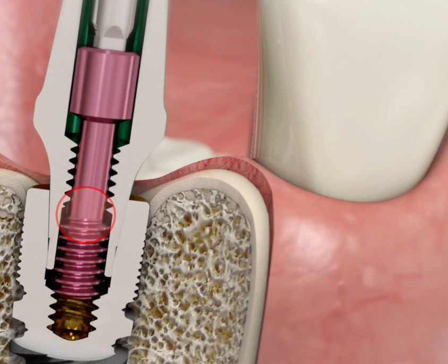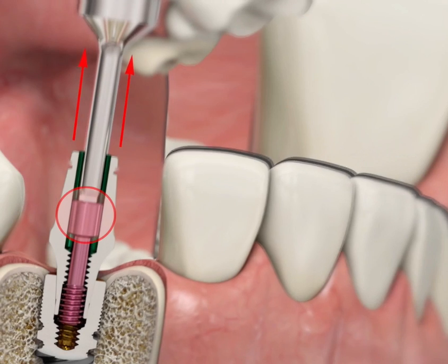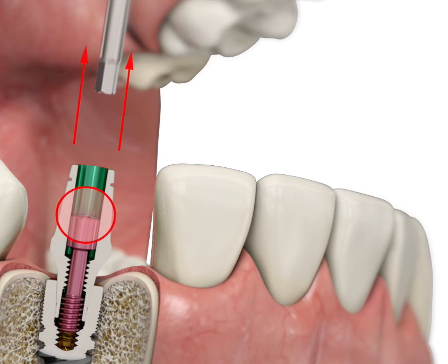When pulling out, do not apply a strong force without rotating the screwdriver in an anti-clockwise direction. This will cause the screwdriver to detach from the fixing screw.